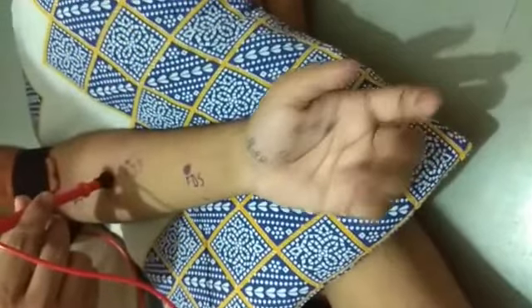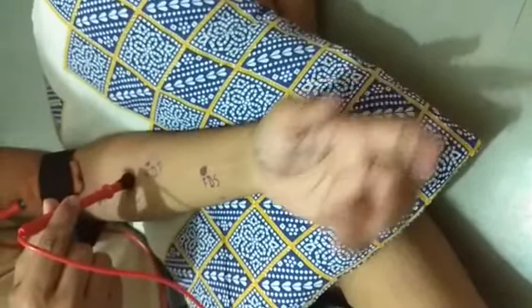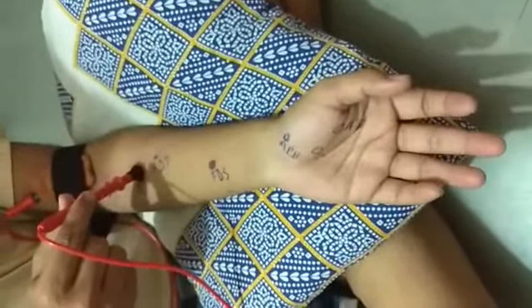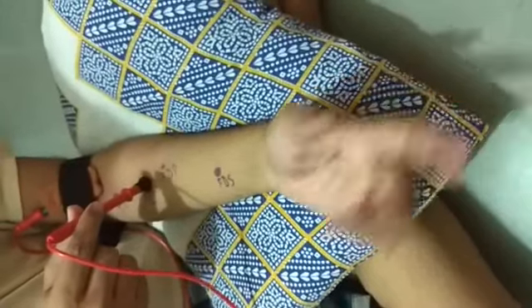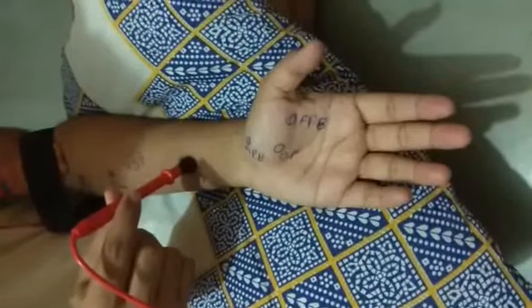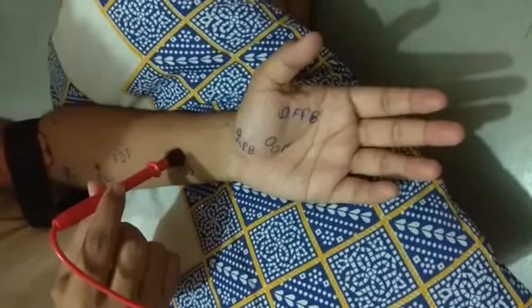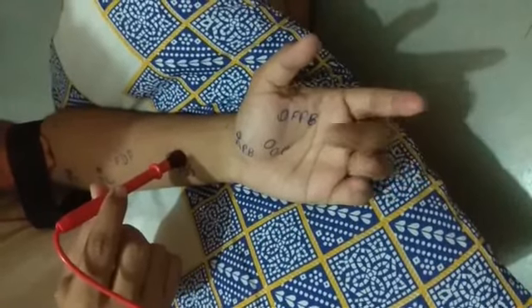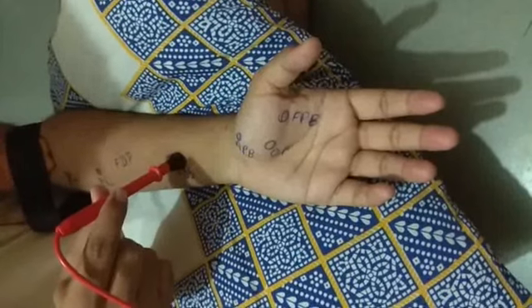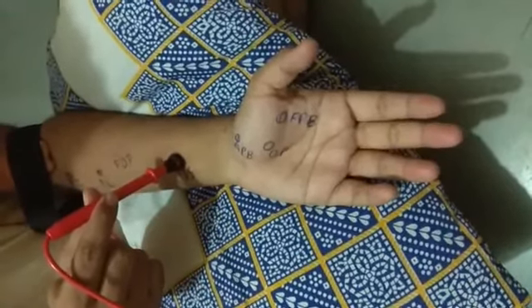This is the motor point for the palmaris longus muscle. The action of palmaris longus is flexion of the wrist joint. This is the motor point for the flexor digitorum superficialis muscle. The action of flexor digitorum superficialis is flexion of the middle phalanx.